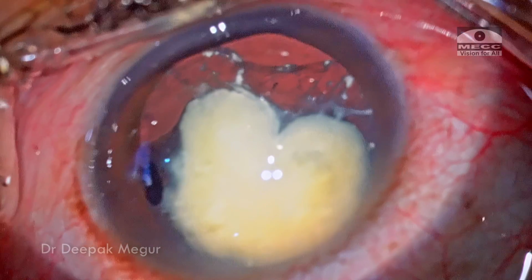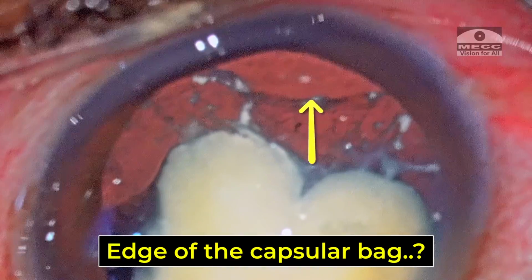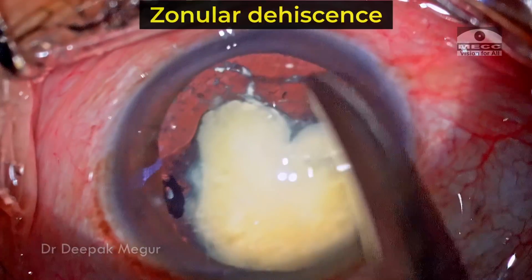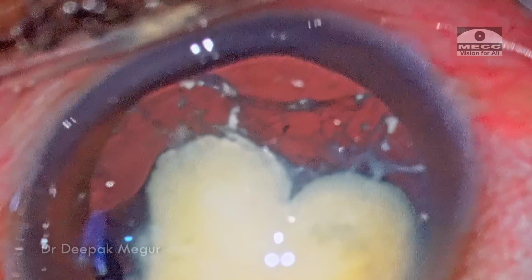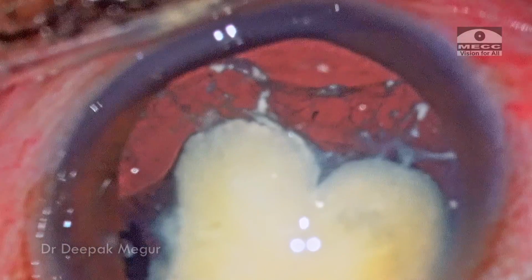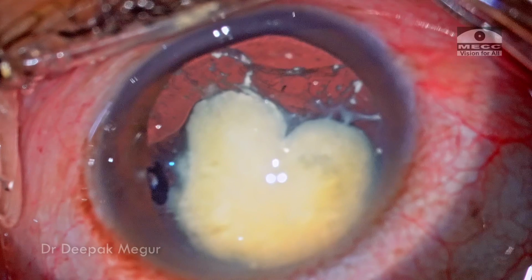Now, as I am scouting around this area, I can see there is a crescent-shaped area in the inferior quadrant. This looks like the edge of the capsular bag. Most likely, this looks like an area of zonular dehiscence, because this is where the capsular bag is ending. This is an empty area, devoid of any zonules. So I guess this is the area of zonular dehiscence. In the rest of the area, the bag is intact.